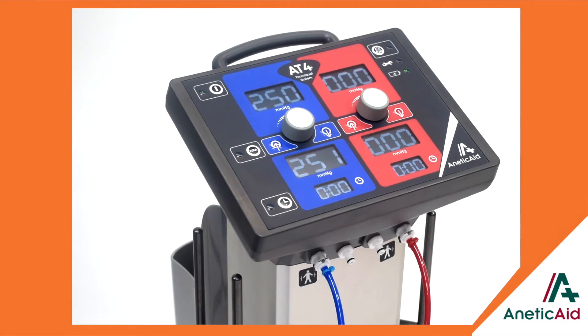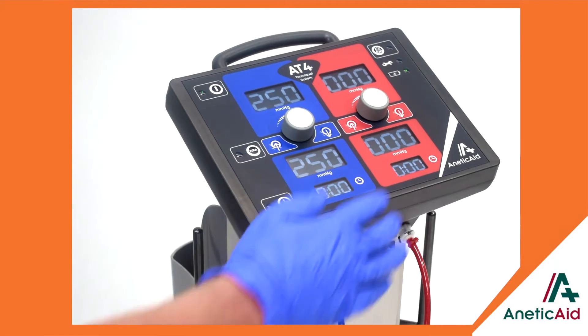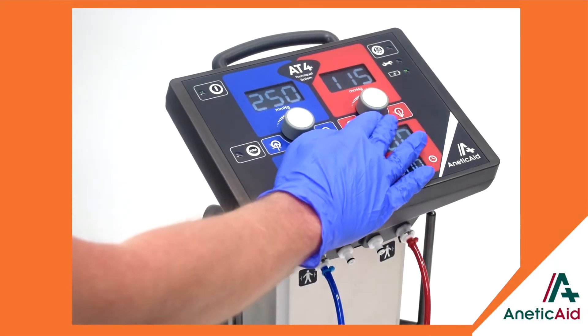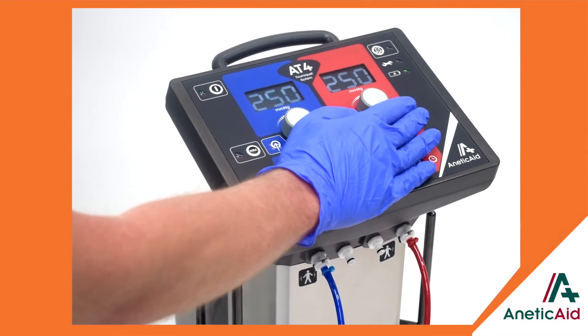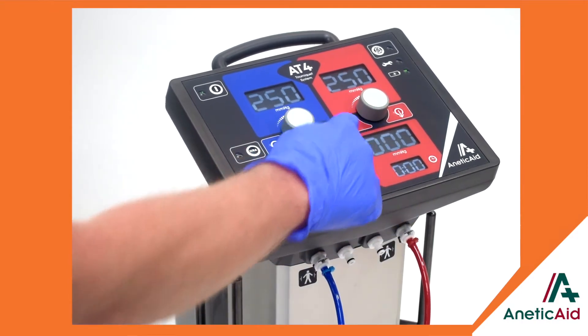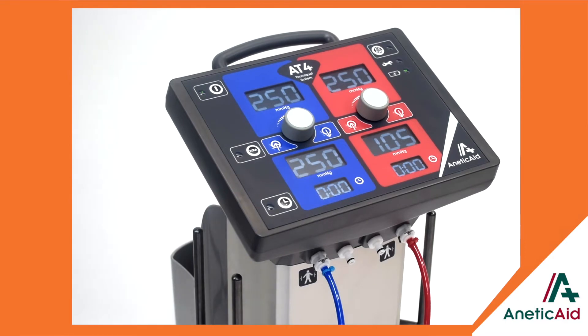The AT4 is dual channel, clearly identified by means of colour, allowing the unit to be used for single or bilateral procedures and intravenous regional anaesthesia. The channels function independently from each other, so changes in pressure on one channel do not affect the other.